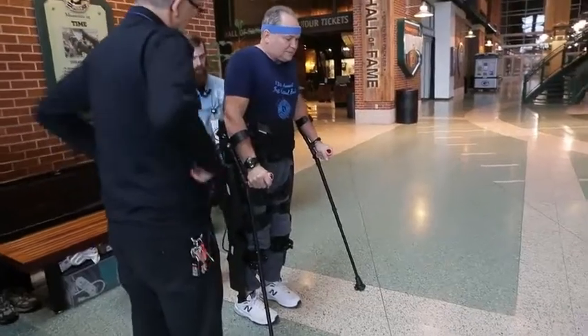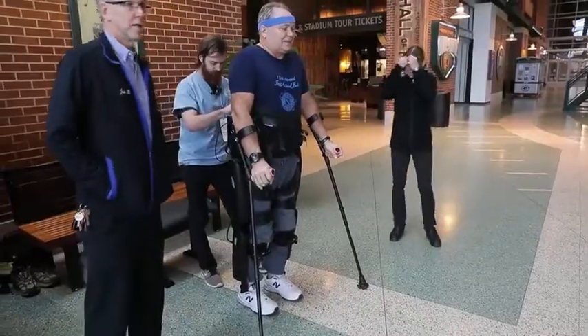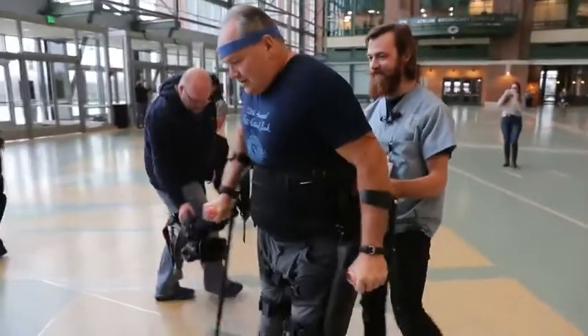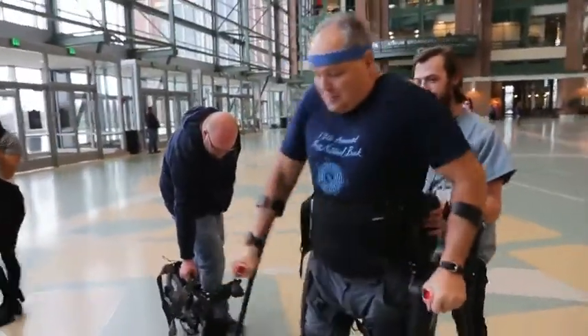Find out how bad my spasms are. Basically, the more I sit still the more spastic I get. I liken it to an able-bodied person learning to walk on stilts — if you're walking on stilts, you have to feel the ground through a wooden or metal leg, and that's basically what I'm doing through the robot, because I'm completely paralyzed from my ribcage downward.